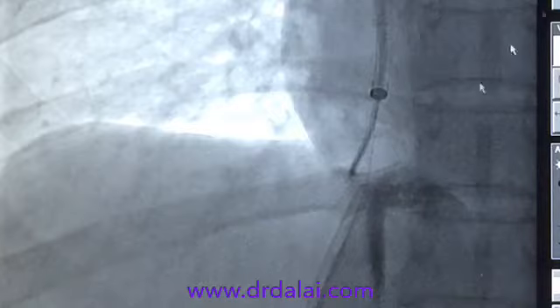Once that is done, you have your 14 wire over here, and then you can push your Chiba a little bit further, do your exchange for a 035 wire, and then finish your procedure. You can see my Chiba is going up here over the 14 wire, and then I can take my diagnostic catheter with a wire back and put my Chiba inside, which I am doing safely. So my Chiba has gone inside over here and the diagnostic catheter has been taken off.